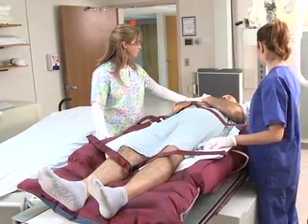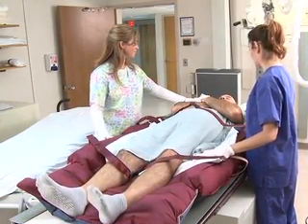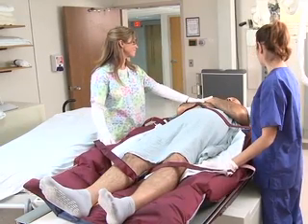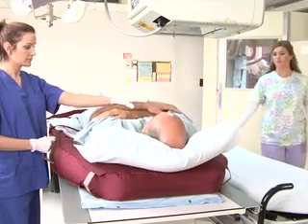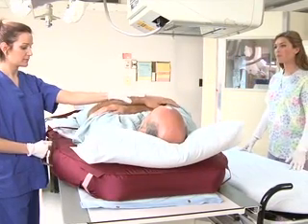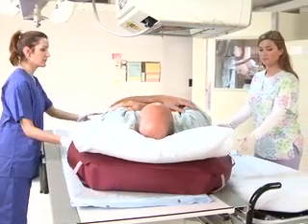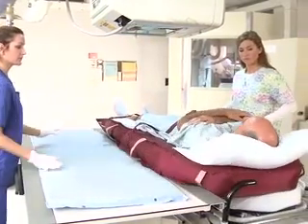Unbuckle the safety straps and position them away from the X-ray site. Perform the X-ray procedure while the patient remains on the deflated HoverMatt. After the X-rays have been taken, use the same safe patient handling technique shown previously to reinflate the HoverMatt and transfer your patient back onto the stretcher.